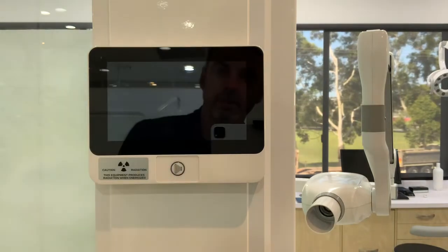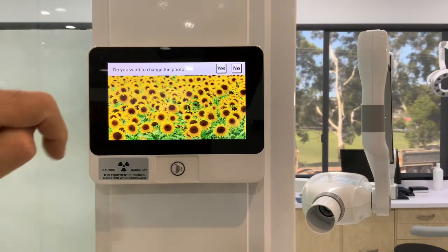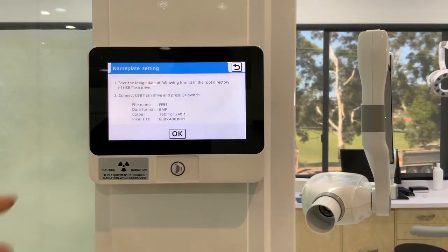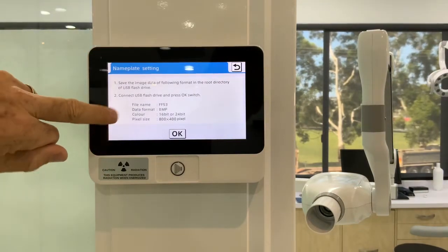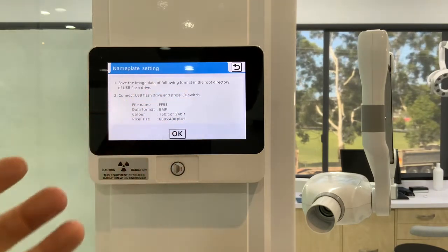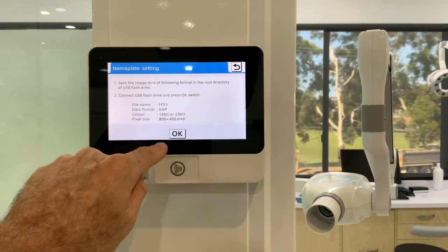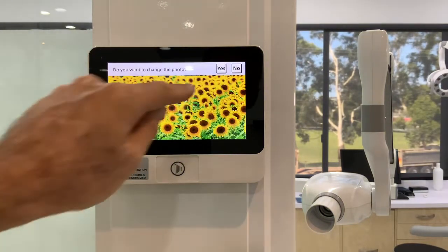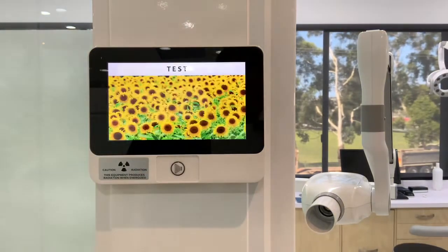We've got our new nameplate. Now it's asking me do I want to change the photo. If I hit yes, it's going to tell me that I need to put in a USB and set it up to those specific formats, then it will load that new picture in. Because I don't have a USB there, I'll hit no and keep the default photo.